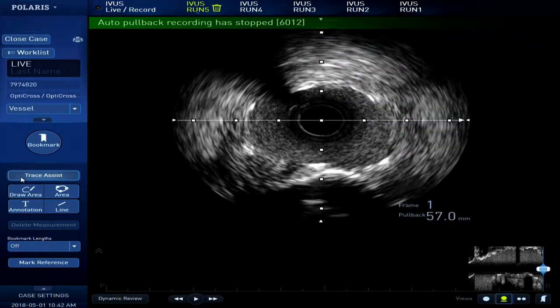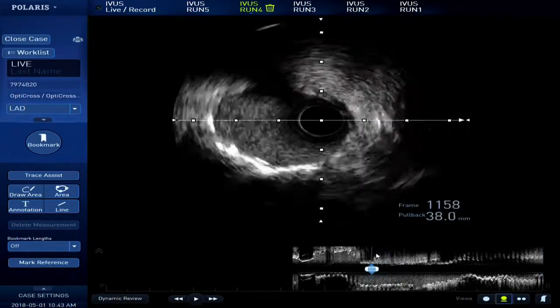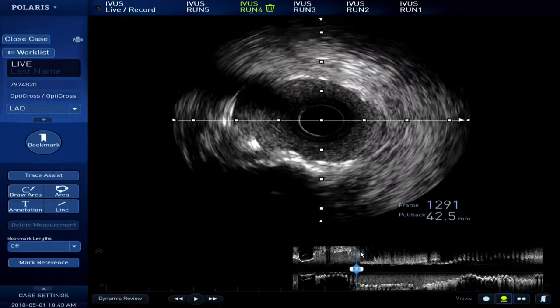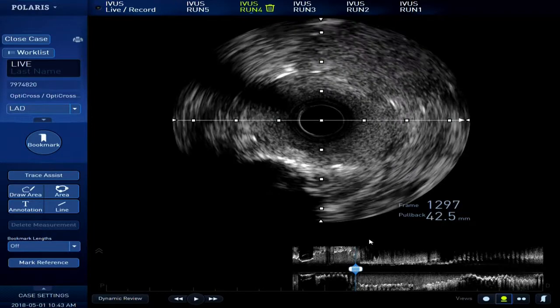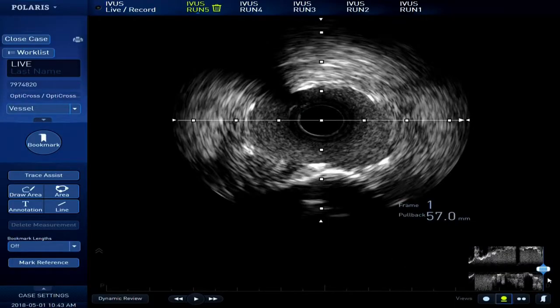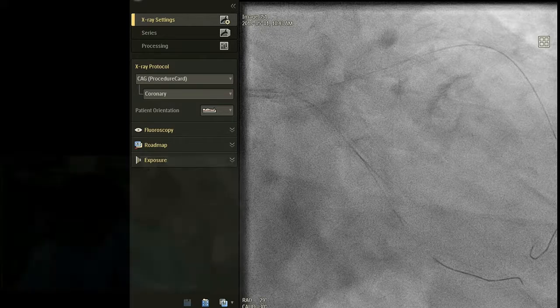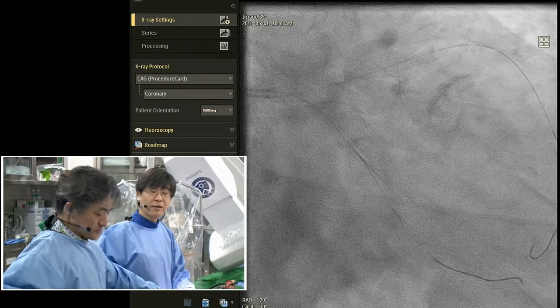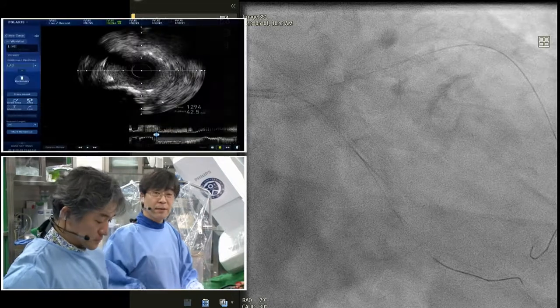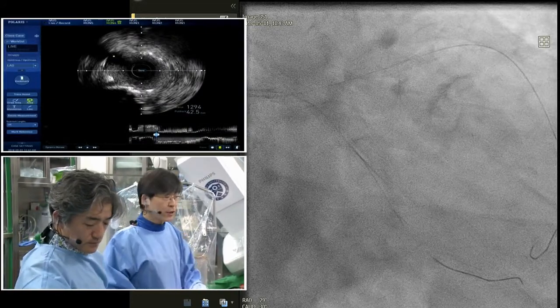And Dr. Serway's comment is that there is some eccentricity, asymmetricity of the stent expansion in the left main. The asymmetry is one of the indices to predict future adverse events in the BRS. But as we know, in data from the drug-eluting stent, asymmetricity is not important. Just a simple and strong predictor is the lumen cross-sectional area.